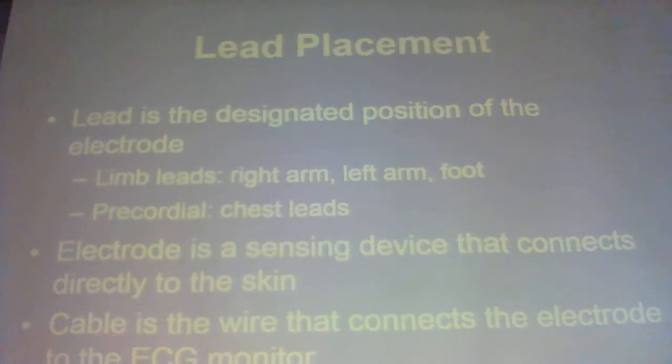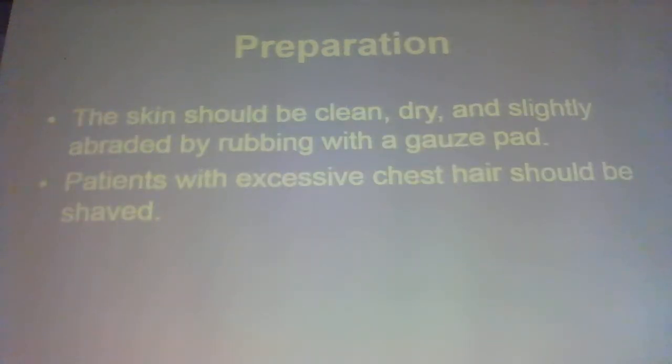It doesn't matter, as long as you clean it off. The only thing about using alcohol is you got to let it dry. So it's better to use a 4x4 or the abrader pad on the back of your electrode just to rub the skin off. We have sandpaper. Well, yeah, it's like sandpaper.